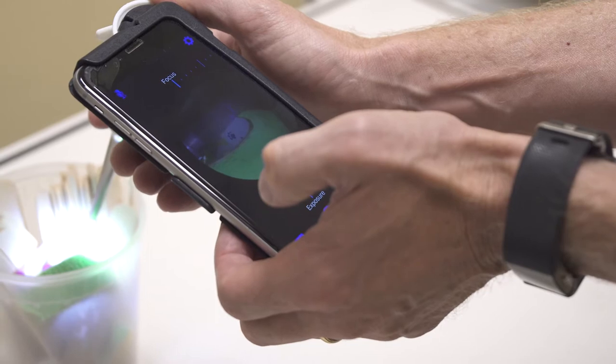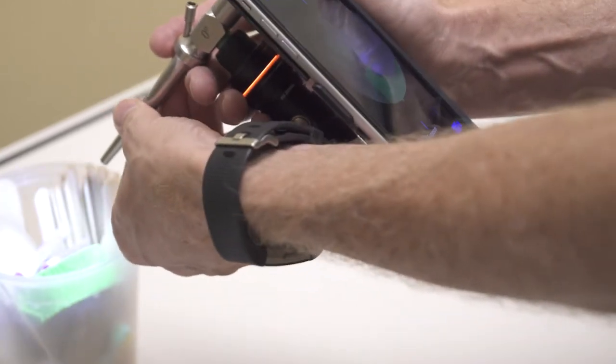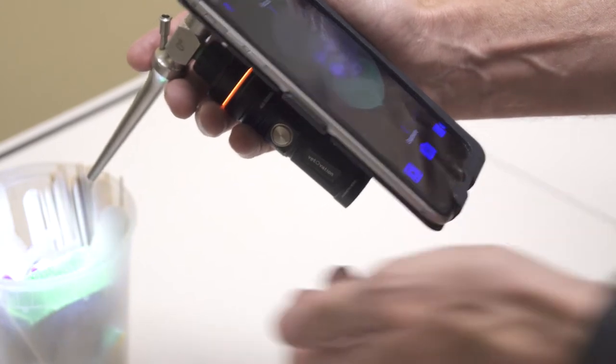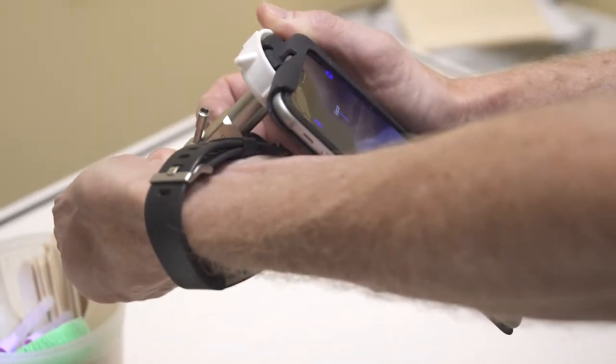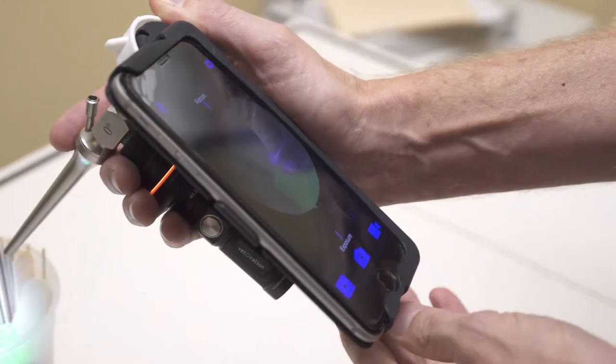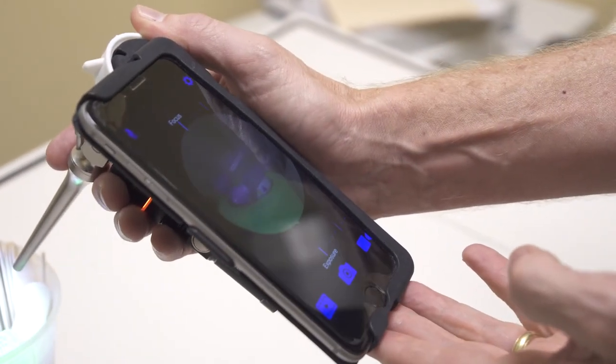A couple of troubleshooting tips and tricks: you've got a cold scope going into a warm patient, so if you can warm your scope up either by holding it with your hand or putting it in a warm cup of water, that will help you have a warm scope and a warm patient so that it doesn't fog.